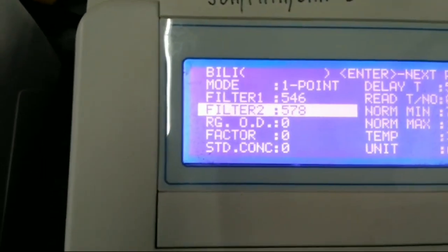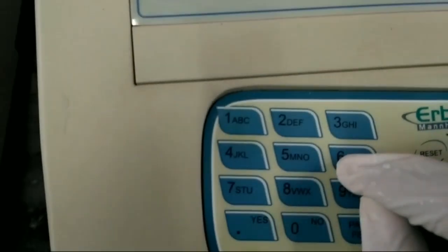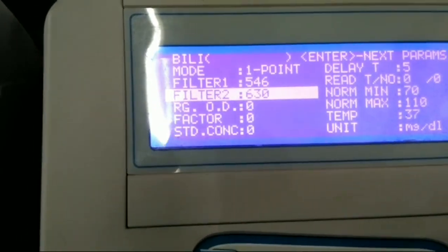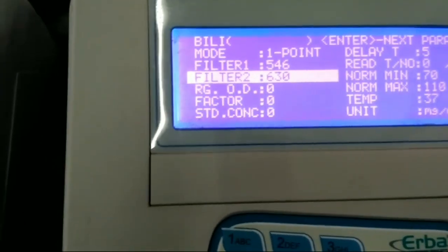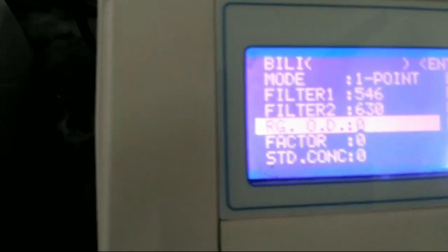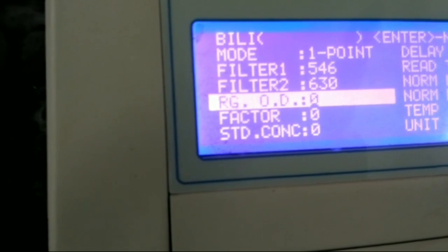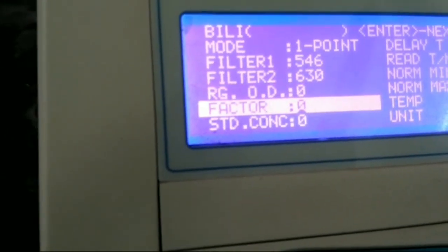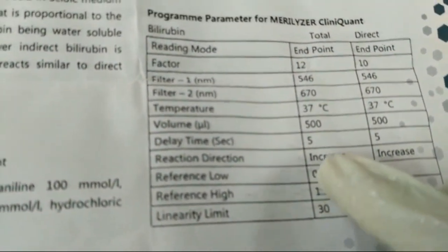The secondary filter options are 578 (switch number five) and 630 (switch number six), which is the highest filter in this machine, so no need to change it. After that, the reagent OD will be generated automatically whenever we aspirate the reagent.